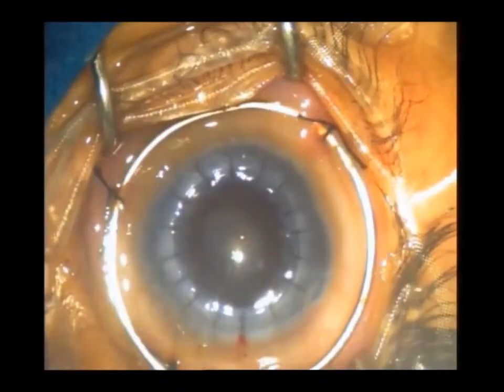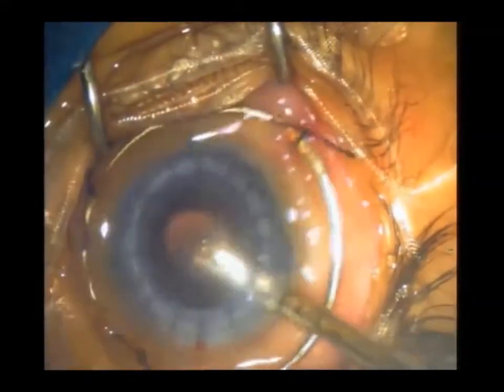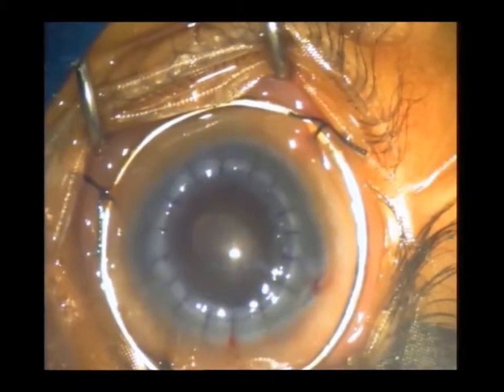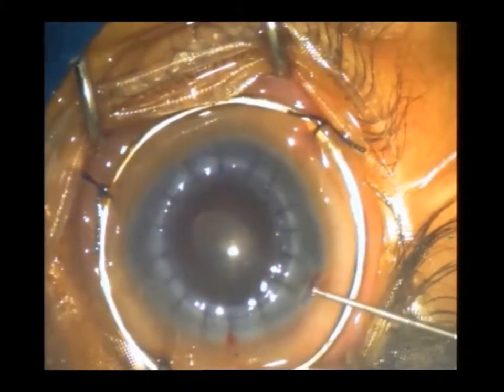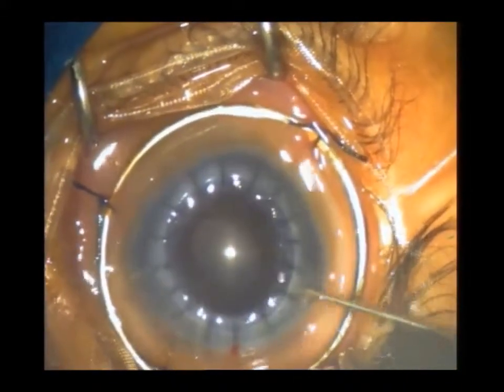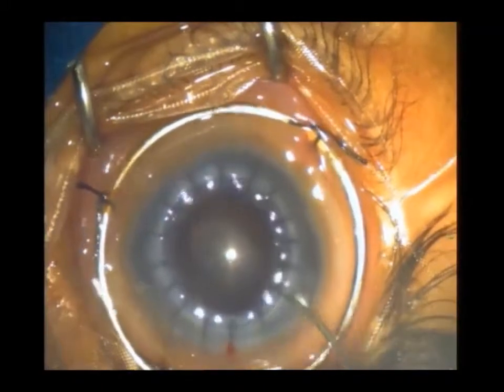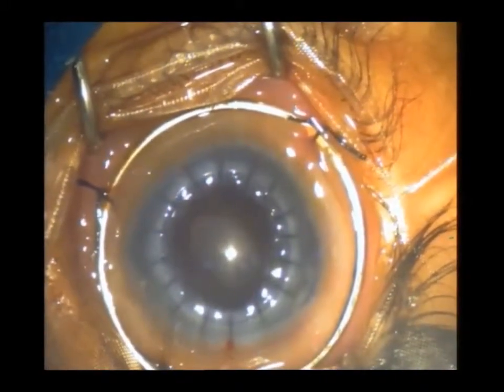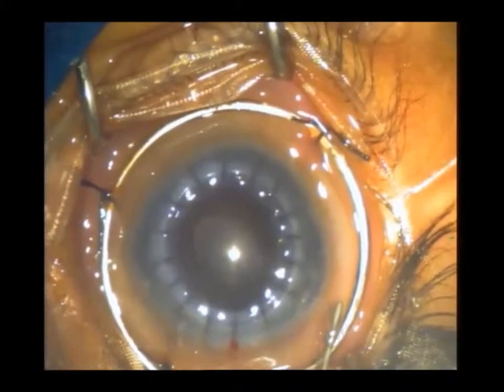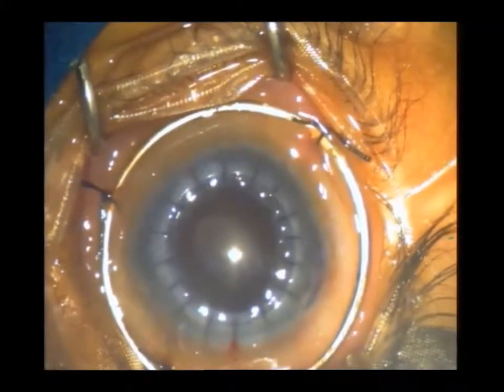Viscoelastic is then washed out from the anterior chamber through a side port with the help of Simcoe's cannula. The limbal fixation ring can now be removed.